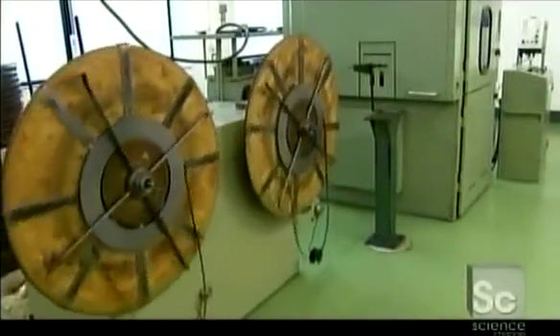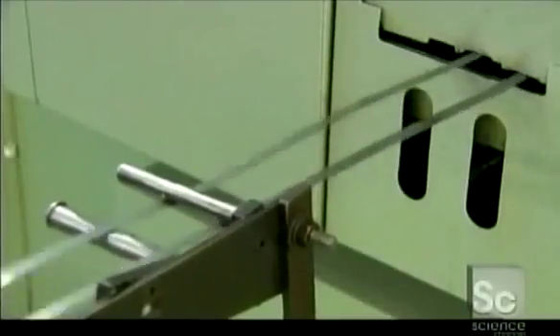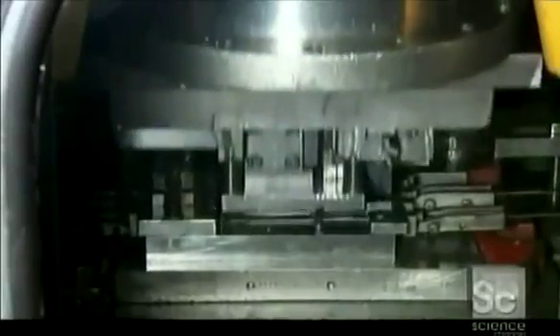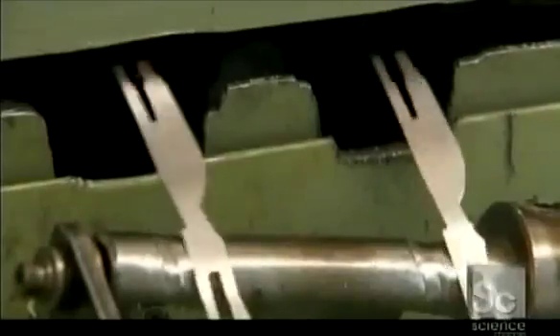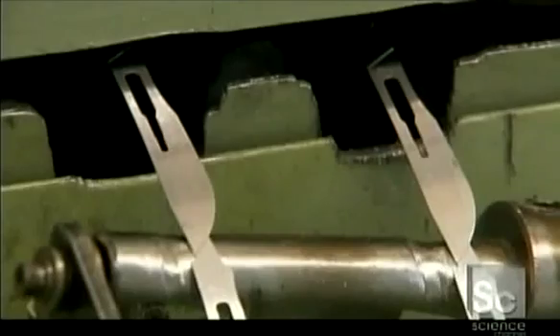The first machine feeds the strips into a press. A die inside punches out unfinished blades called blanks. Blades will vary in size and contour, but they all have the same center slot for attaching the handle.